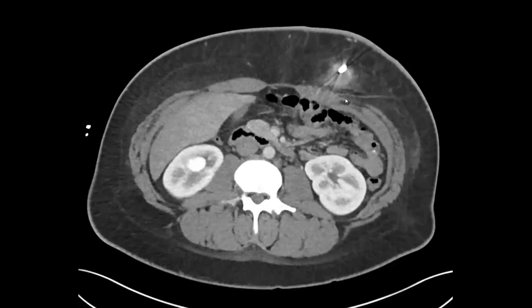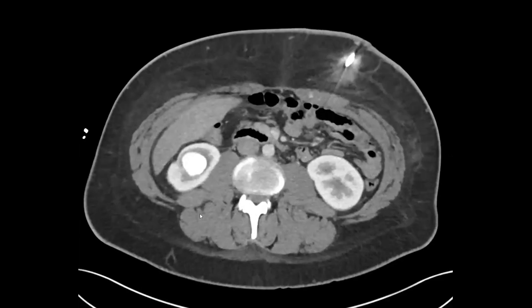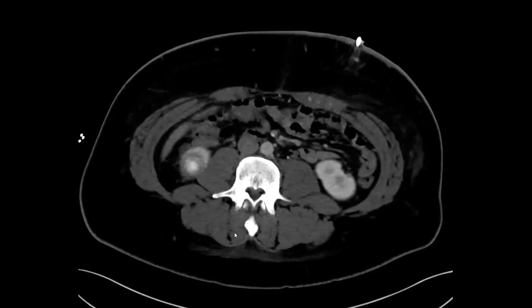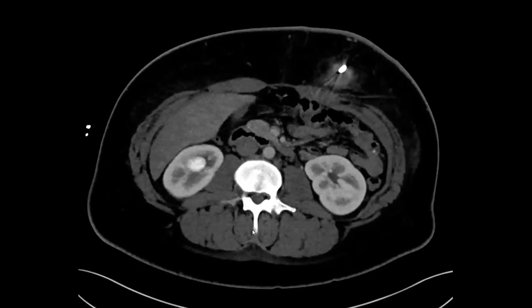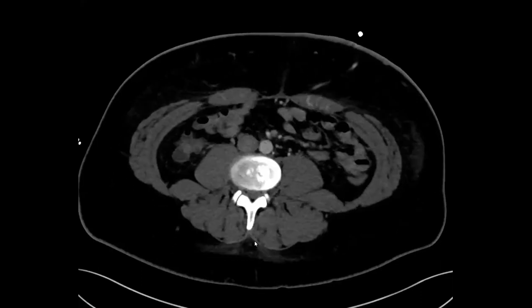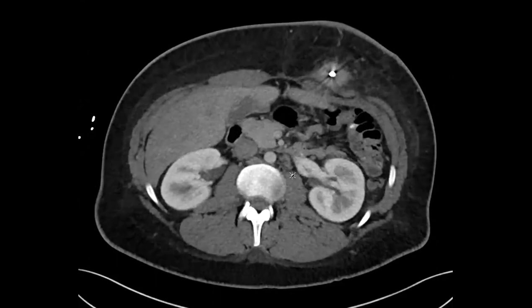This was concerning for a driveline infection — they were checking if there was pus coming out of the skin. Now, tell me about this kidney. There's a really bright blob in the kidney. It almost looks like extravasated contrast. It doesn't look like contrast within the collecting system, but we're not in the excretory phase of the kidneys yet, so why would there be bright contrast there?